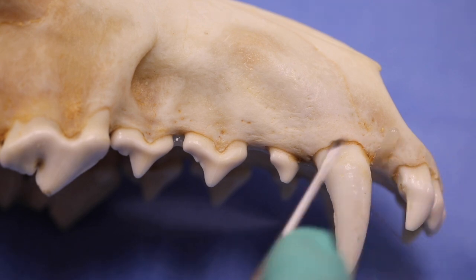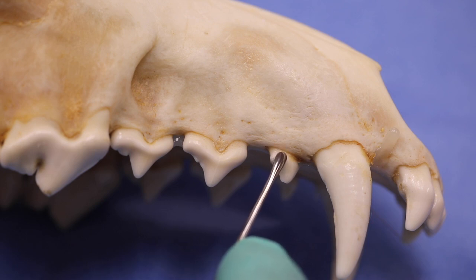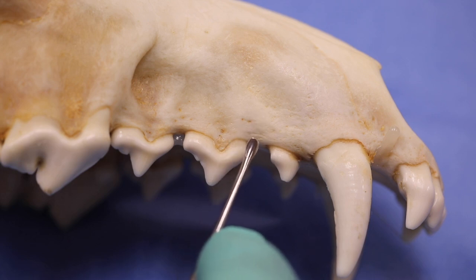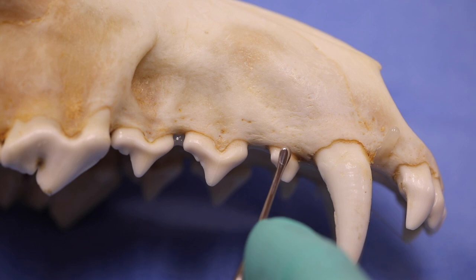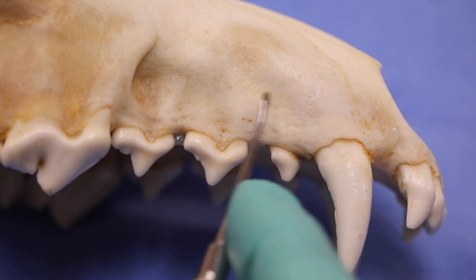The tendency is to push this way with the elevator — placing it underneath the marginal gingiva and then forcing it up toward the apical area. That's absolutely not the way we want to do this. Number one, we don't want it to be parallel to the tooth. Number two, we want a little angulation, usually about a 15-degree angle. We get down underneath the marginal bone, and the gingiva underneath the junctional epithelium is attached to periosteum very firmly throughout a whole zone.